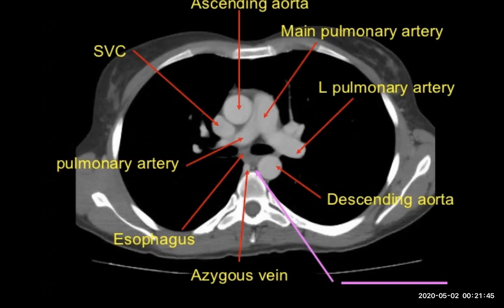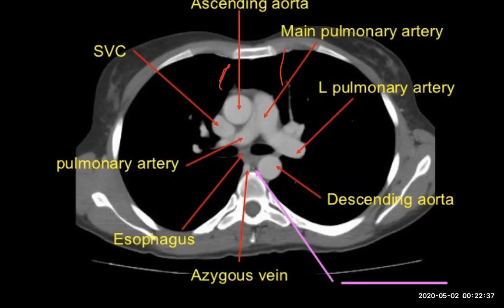Some important structures seen on one slice of the CT scan of the chest include: ascending aorta, descending aorta, main pulmonary artery, right and left pulmonary arteries, SVC (superior vena cava), esophagus, right and left main bronchi, azygous vein, and descending aorta. We must also know the internal thoracic artery and mammary vessels — the vein is on the medial side, the artery on the lateral side.